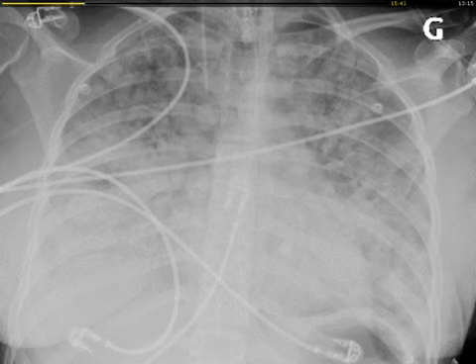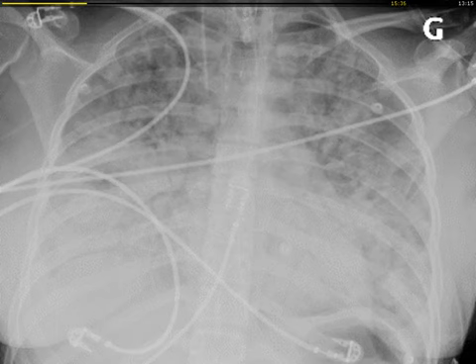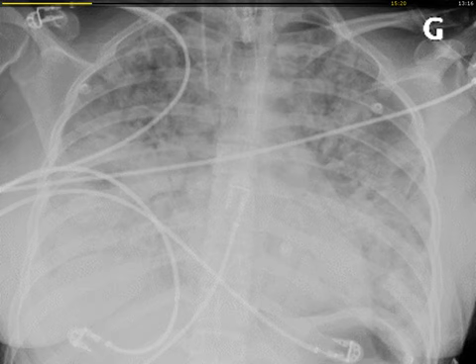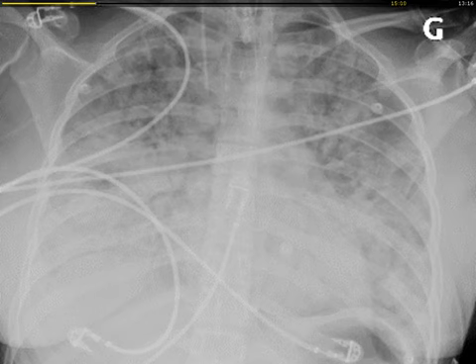So now, currently, can we close this panel? Yeah, we see that the patient is totally passive. She's sedated. The minute volume controller is adjusted according to the end-tidal CO2. So currently, the end-tidal CO2 is within the target range, so minute volume is not changing. And for this given minute volume, the ventilator measures the respiratory mechanics, namely the expiratory time constant. It's currently very short. Why? Because this patient has a very low compliance, 34.